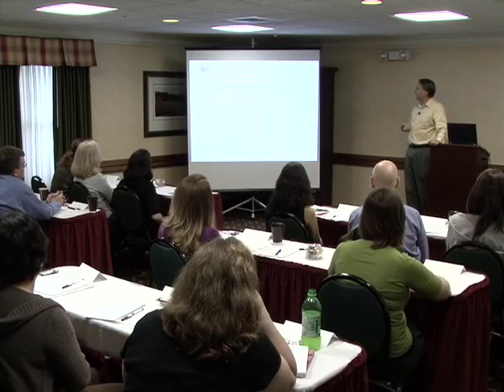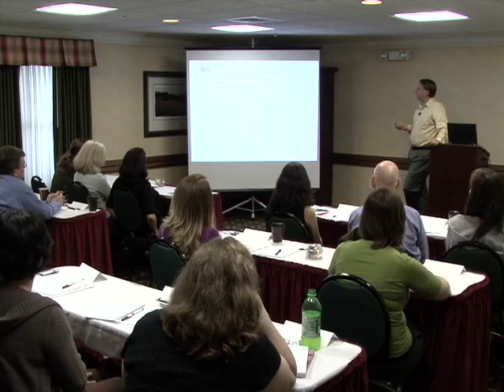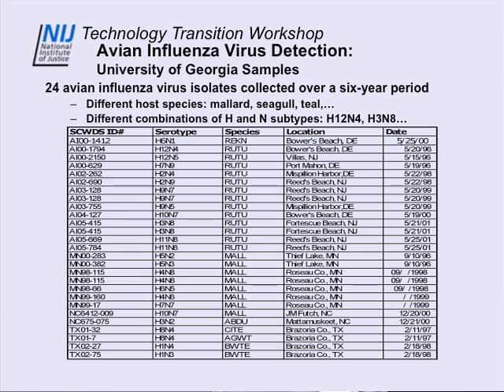Same primers, same software, same hardware, same everything. So we got a set of diverse avian influenza virus isolates from Dave Stalnick at the University of Georgia. These were collected over a 6-year period from different host species, all different funky serotypes, H and N types we'd never seen in the lab before. We'd never seen a H10N7 in the lab before, but we'd seen it bioinformatically, so it was considered in how we designed the primer pairs to cover it.